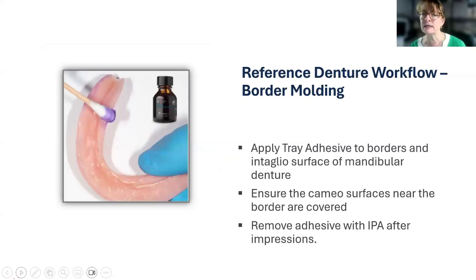And here is a good tip. You want to apply adhesive, so tray adhesive, to the intaglio of the denture itself to allow that impression material to adhere and stick so that you can scan it appropriately.